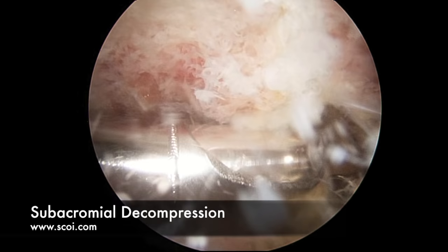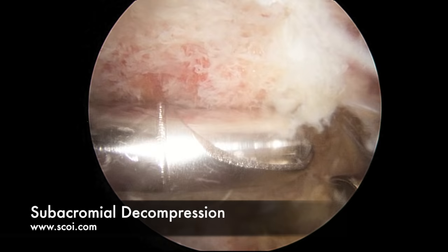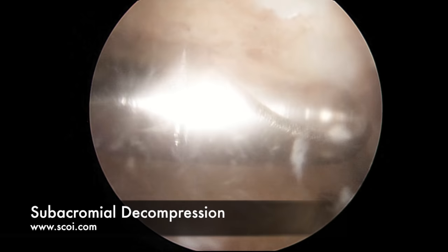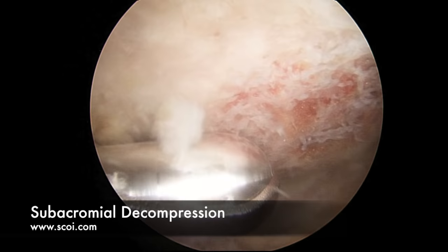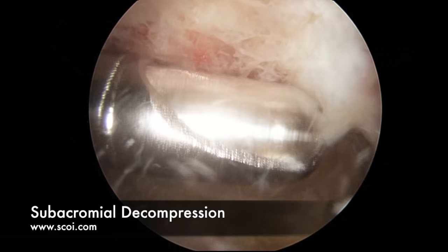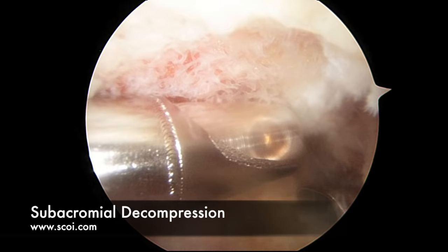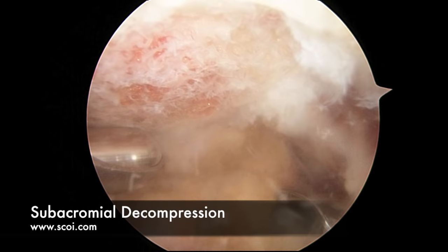With our shaver we perform the subacromial decompression, removing the bone to make it flat. Once we've removed the overlying bone spur, we've got a flat surface here that should not dig into the rotator cuff and cause any more impingement.